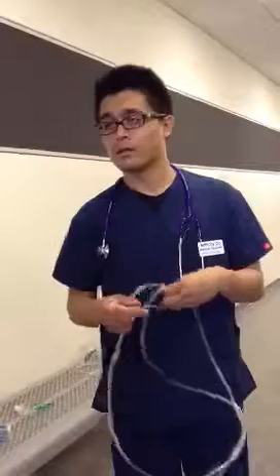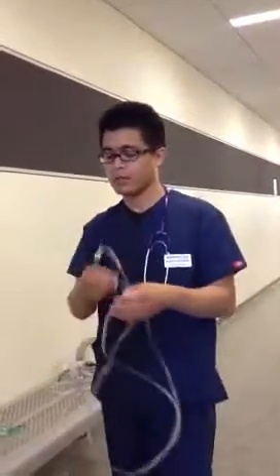After you do that, you want to stay with the patient for a bit, 5 to 10 minutes, make sure everything's okay. Check that their status isn't changing because of the fact that you placed them on it. Then you're going to take heart rate, respiratory rate, breath sounds, and saturation so you have hard data that nothing in their position has changed or gotten worse. You just want to see it get better.